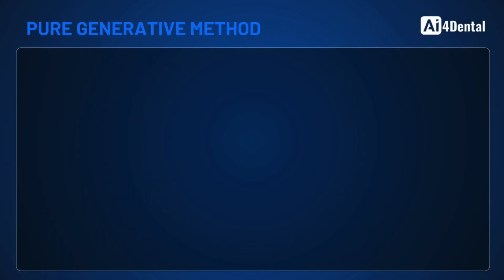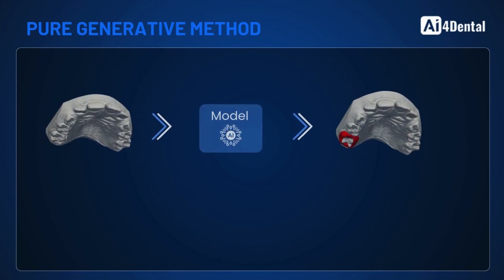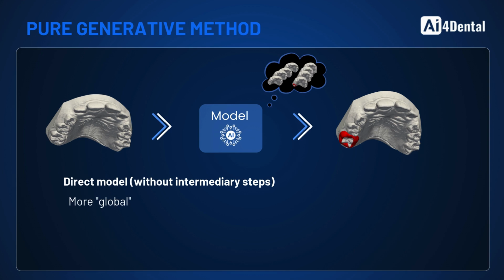We have discussed assisted CAD, automatic CAD, and now the future, the pure generative approach. The generative approach eliminates intermediate steps, producing prostheses or orthodontic devices directly from raw scans. Though seemingly far off, this goal is closer than it appears. Generative models adapt to unique cases by being trained on diverse data, including rare anatomies. This removes the need for specific geometric solutions, as the model learns to handle complex cases automatically.